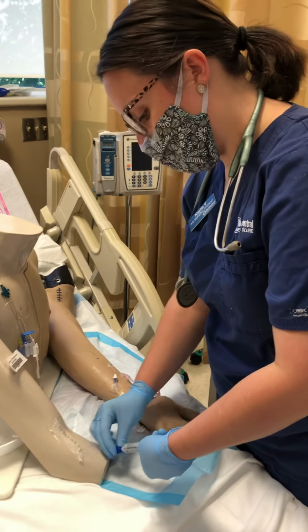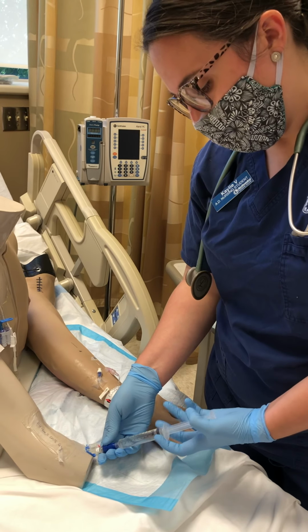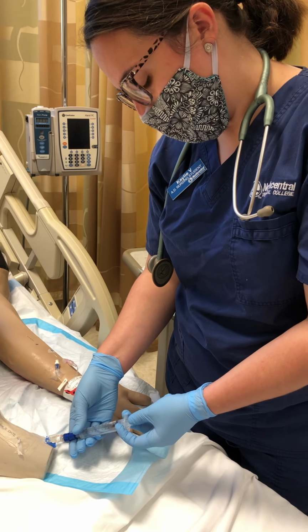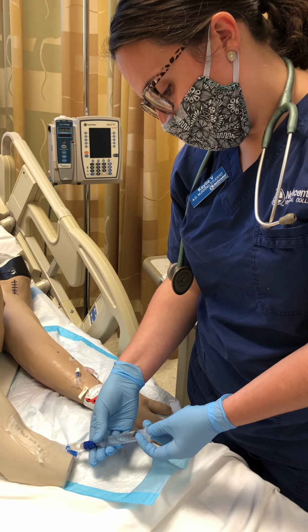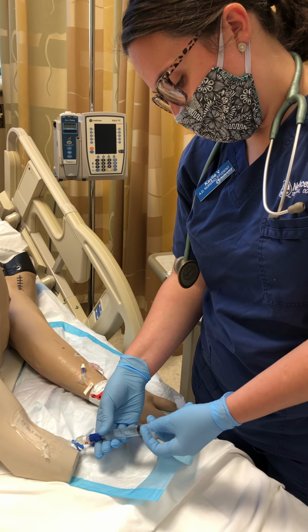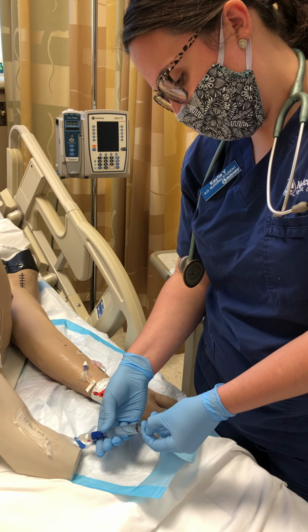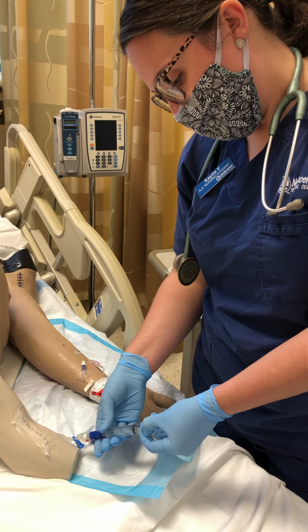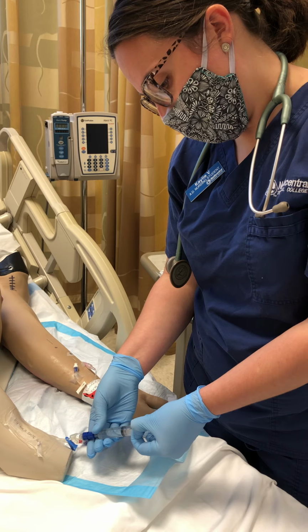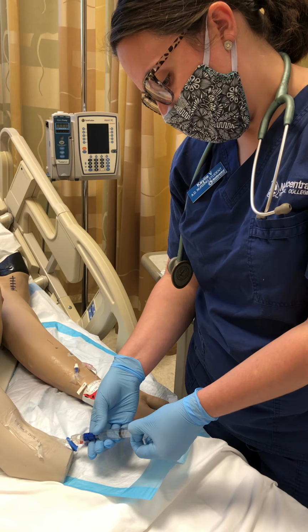So the first 5 mLs I'll administer over 1 minute. The second I'll pulse in. And then if available, you have the little green capsule put on there to help fight infection. For pediatric patients, you'd probably push it a little bit slower, and always have a parent there to keep your child still, just make sure it's stable and fine.